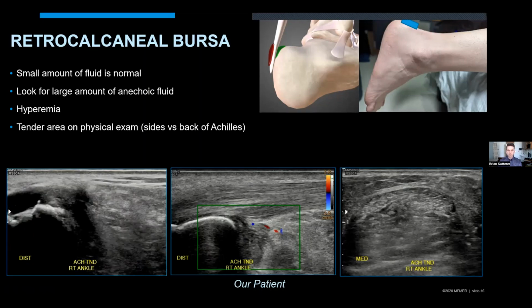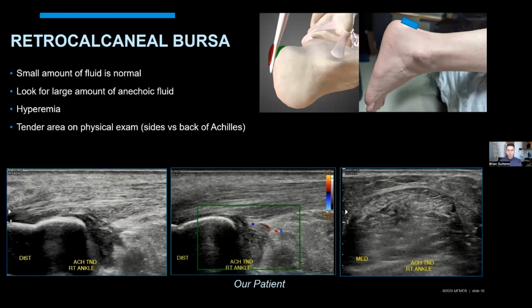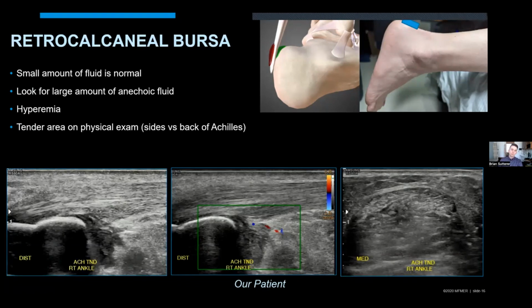clinical presentation, meaning we see somebody with retrocalcaneal bursal fluid. We'll often see retrocalcaneal bursal hypertrophy. We'll often see some deep tearing of the Achilles insertion, and we'll often see this prominence of the posterior superior calcaneus, which really paints this picture of Haglund's syndrome. And so I think taking all of those into consideration, when you're looking at the patient from the entire clinical picture rather than just your ultrasound, is important there. So that's all I got.